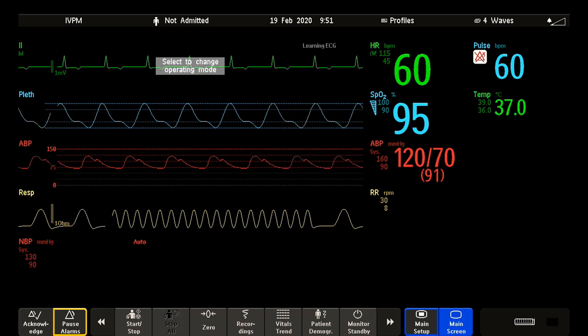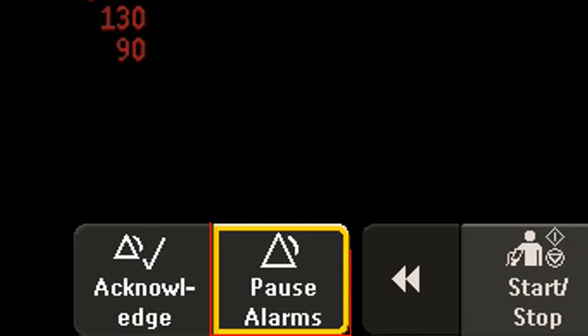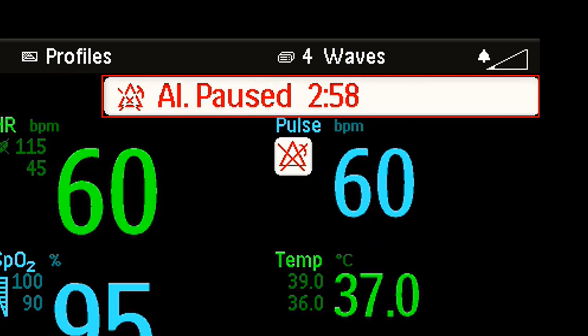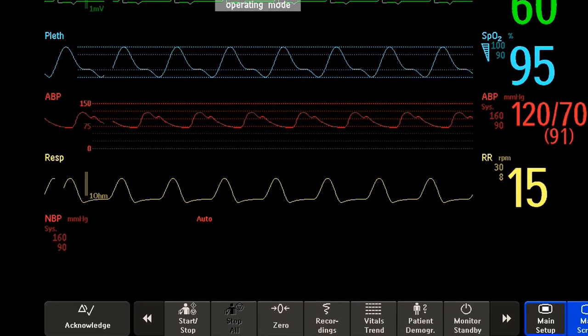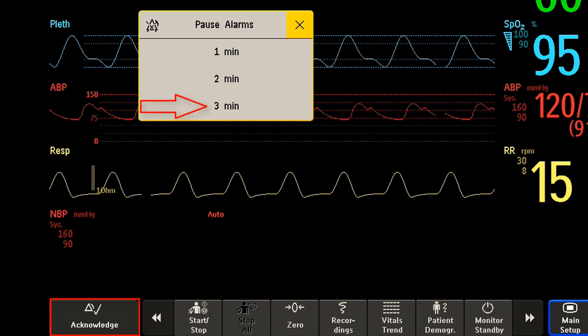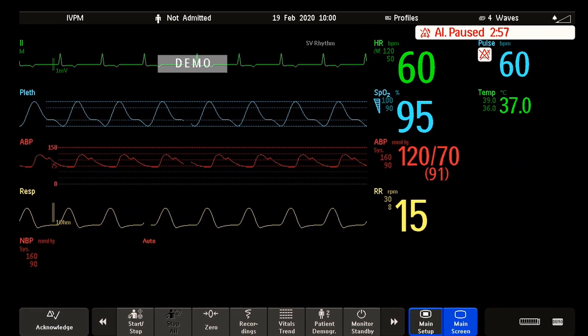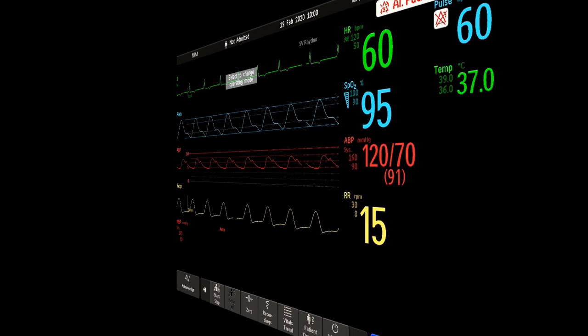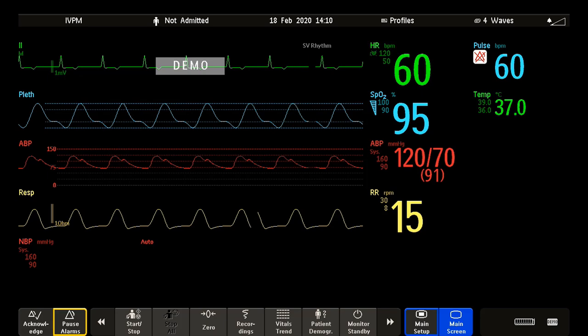If you want to temporarily prevent alarms from sounding — for example, while you are moving a patient — you can pause alarms. Your monitor can be set up to pause alarms for 1, 2, or 3 minutes, or infinitely. If you don't see the pause alarms key on your screen, select and hold the Acknowledge key and then select the desired time. It is also possible that your monitor doesn't allow a pause alarm. Remember to always leave the alarm switched on when the patient is unattended.